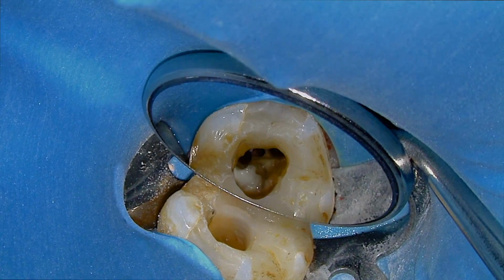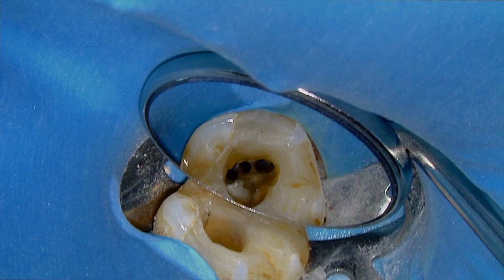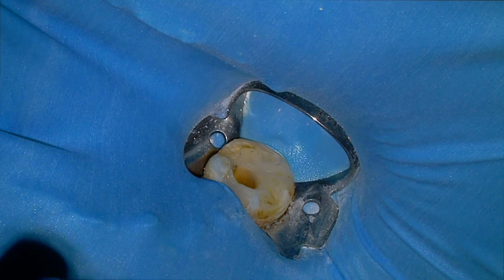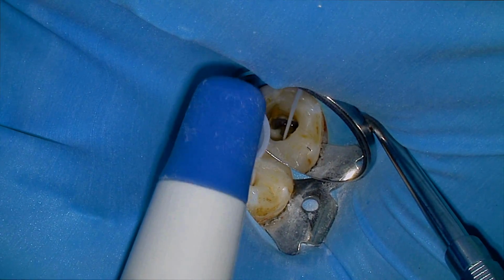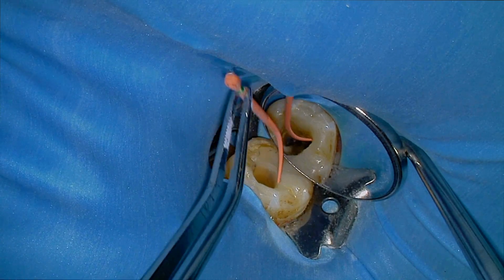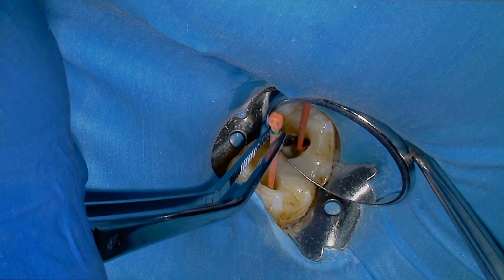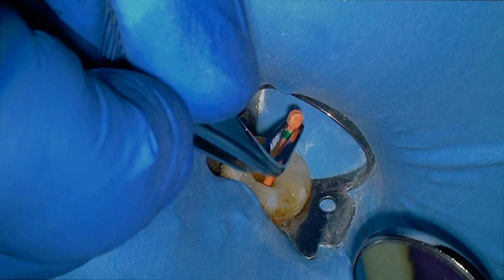And here's the final product. So what we're going to do now is disinfect with our final irrigation protocol. We're going to rinse with sodium hypochlorite, then activate it, then use EDTA, and we'll reactivate it with the EndoActivator. Just before I dry the canals, I'm going to fit in my gutta percha, so I still have a little bit of hypochlorite sitting in the canals, and we're going to check our working lengths. Then we're going to place paper points and dry our canals.